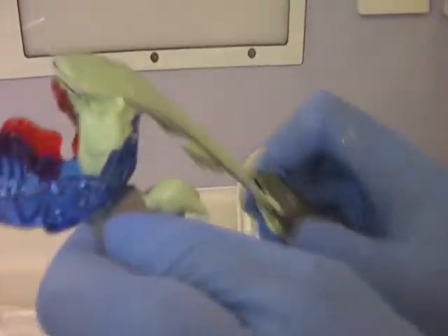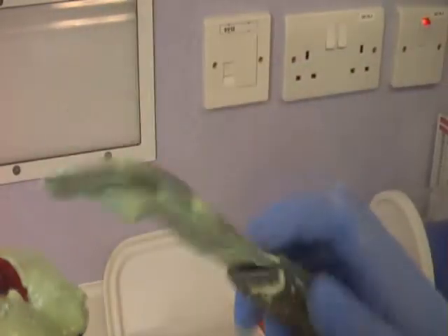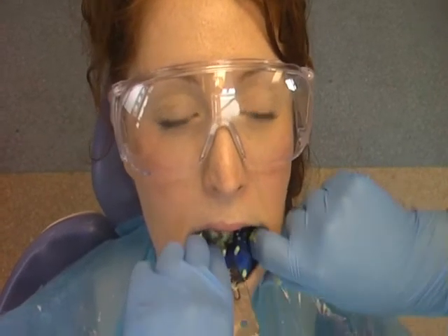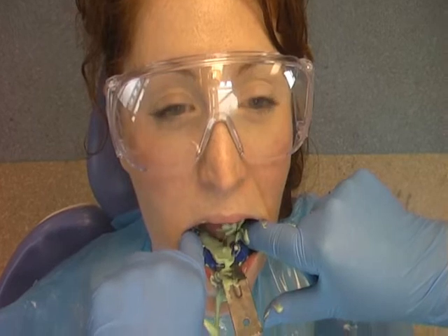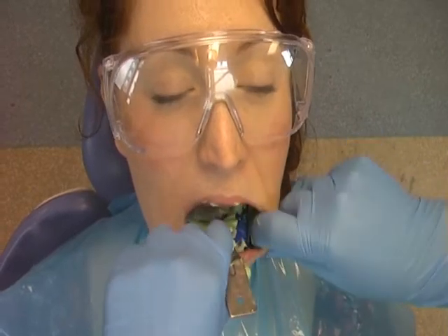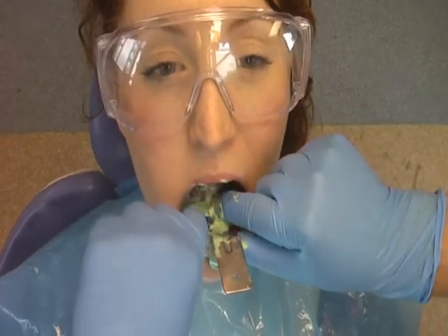Add the alginate to the tray in two stages as this will make sure that it is fully loaded. You should stand in front facing the patient whenever you are taking an impression of the lower arch. Fully seat the tray and as soon as you can, ask the patient to stick out their tongue until it is fully protruded, then get them to move it from side to side in functional movements. Use one hand to hold the tray in place and with the other hand move the cheek around so that you can get an impression of the buccal sulcus.